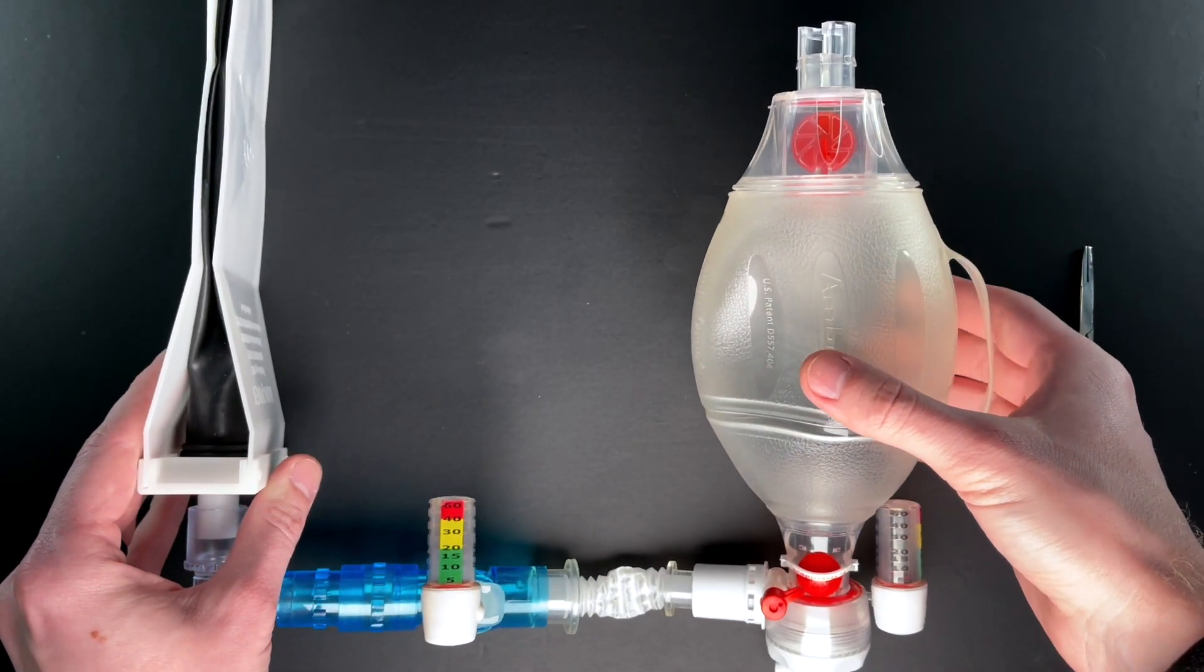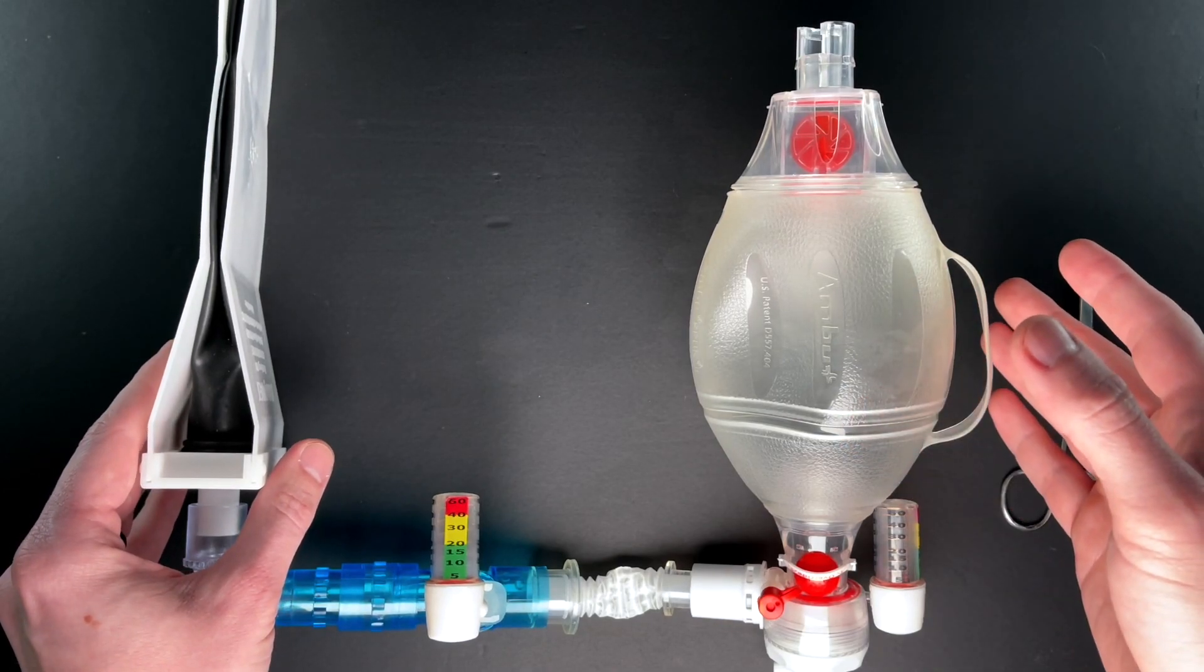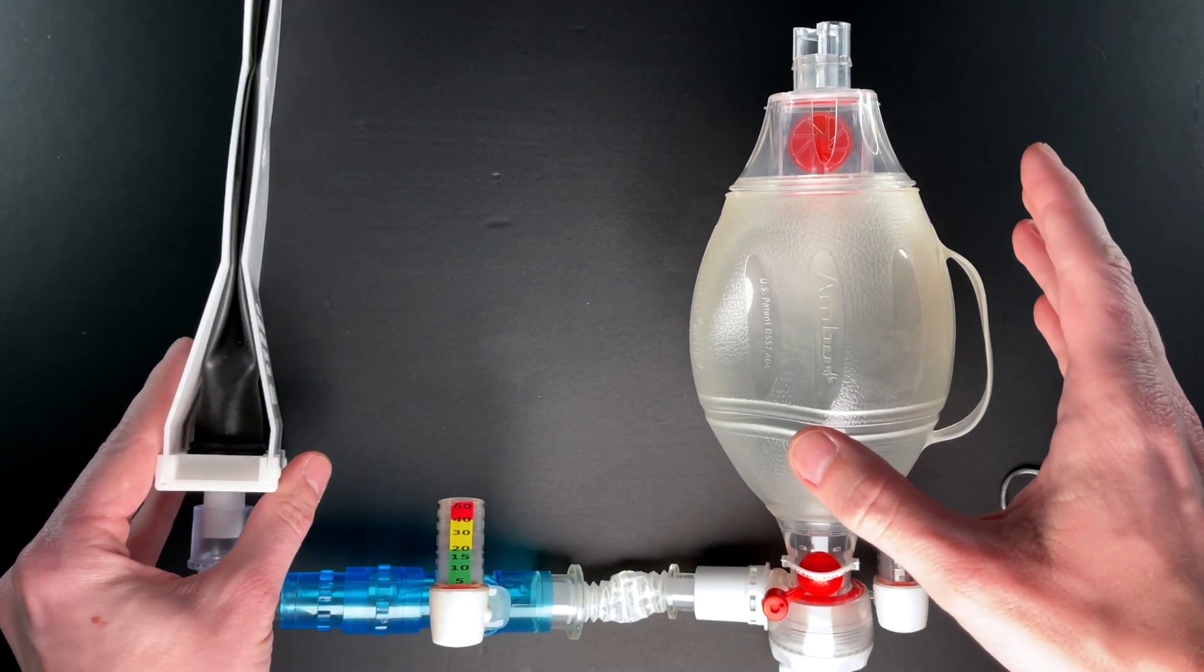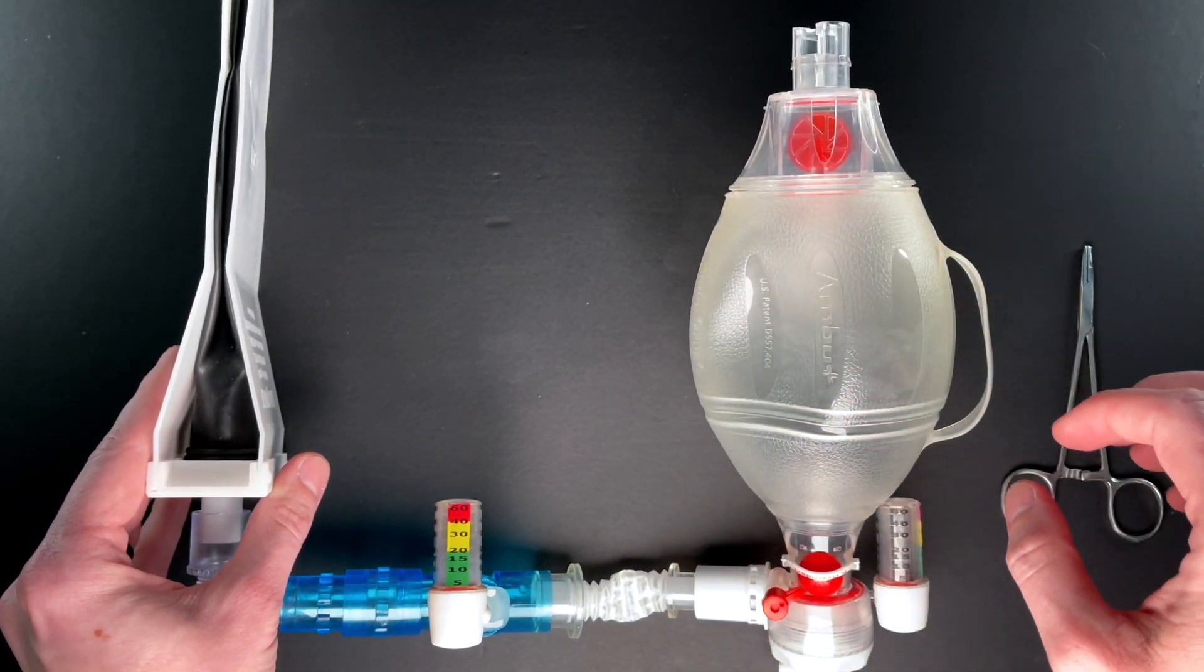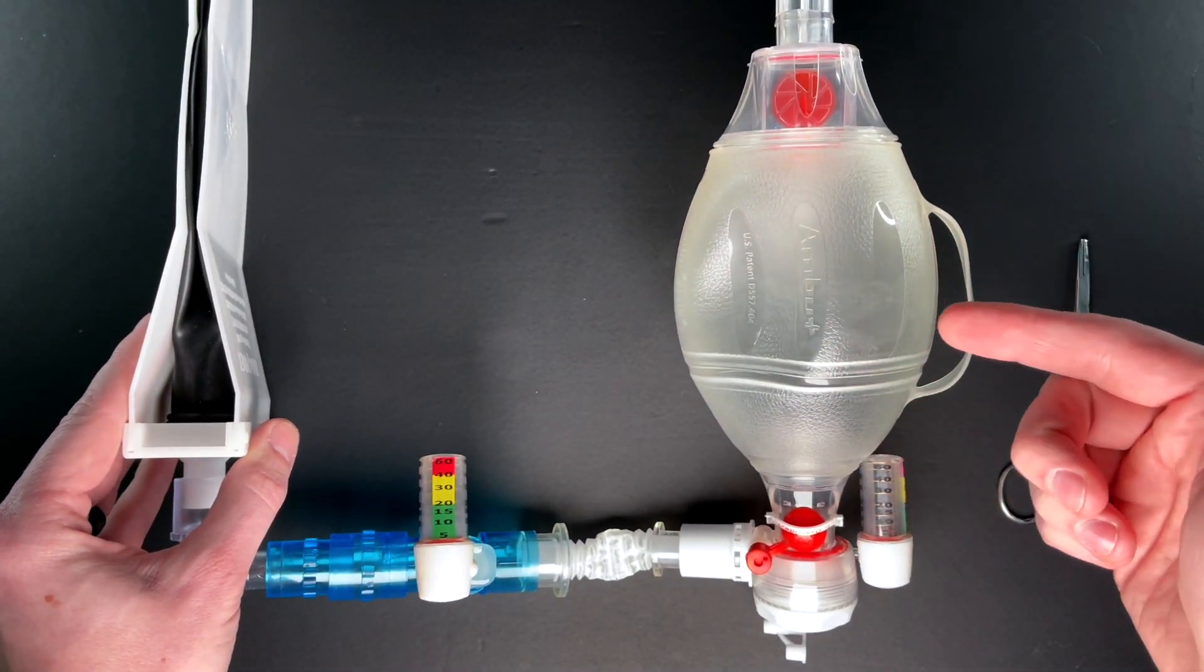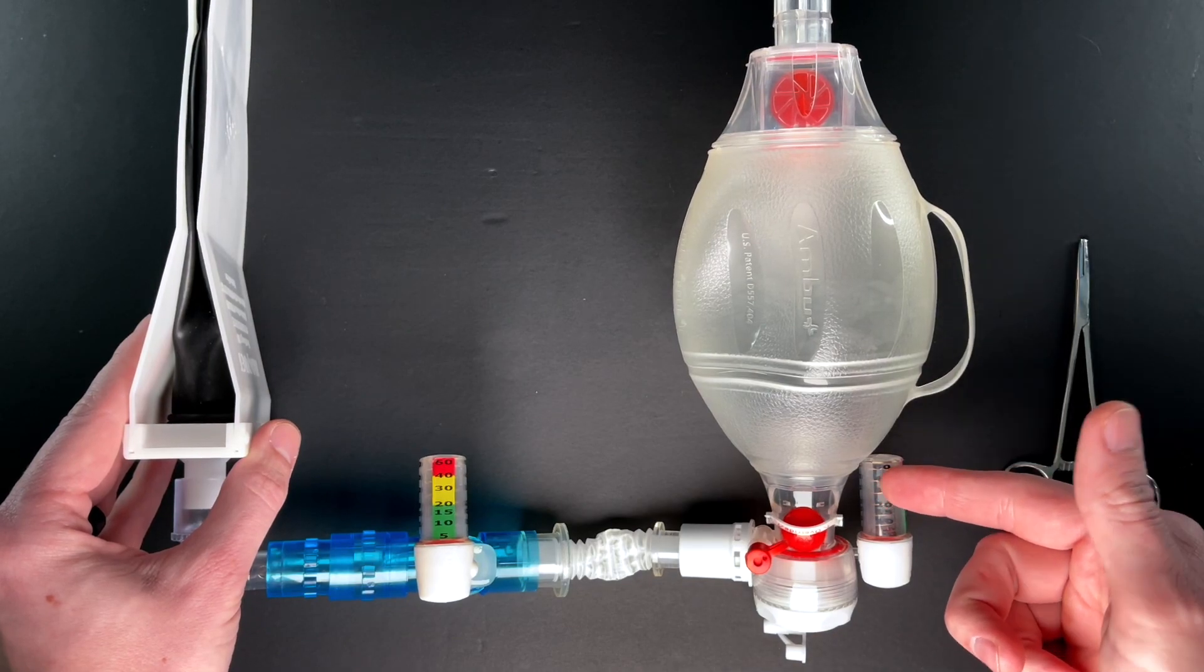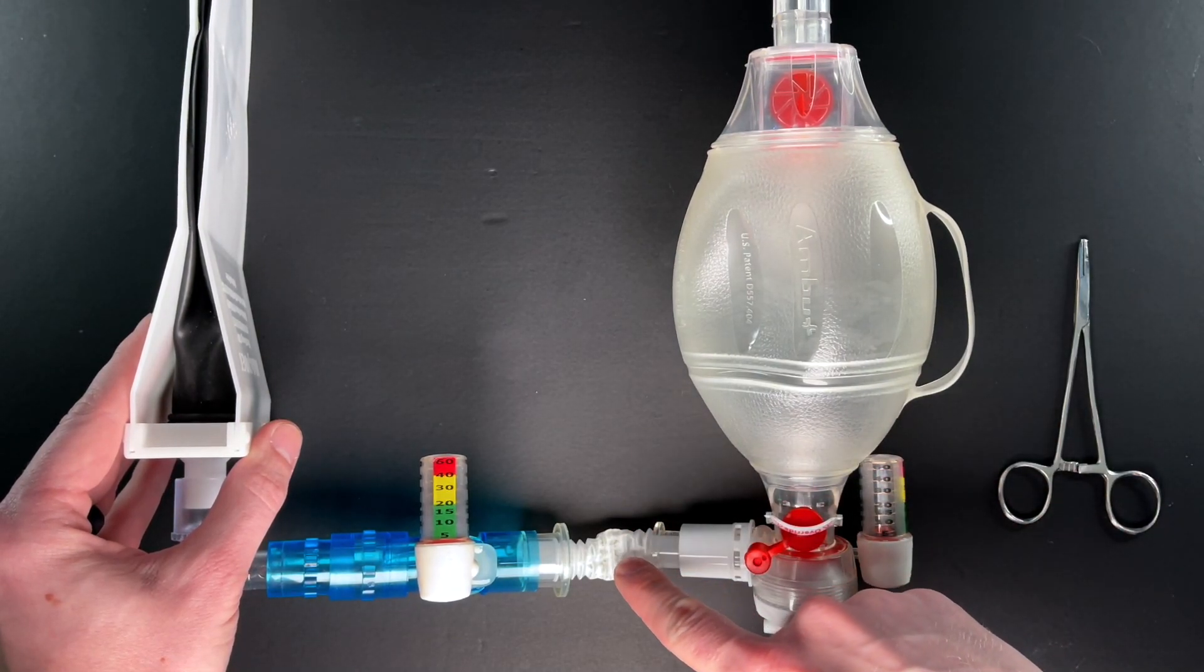Quick refresher on bagging somebody with increased airway resistance. We're looking at the difference between compliance and resistance. The setup here is just a bag valve mask with a pressure manometer that's going into a piece of flex.